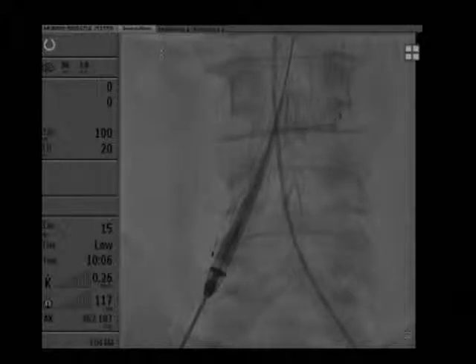We have to cannulate the contralateral gate and then put an extension on the left side. So first thing I'm going to do is get this catheter out. Show the catheter, please. Right now it's trapped under the graft, but that's okay. We will actually use a glide wire, the angled Terumo glide wire, please. With a little bit of push and pull, you can get this catheter out without displacing the graft. The graft is actually now anchored.